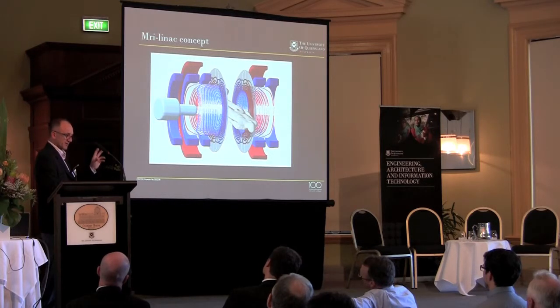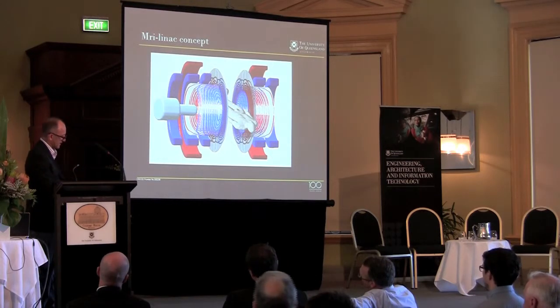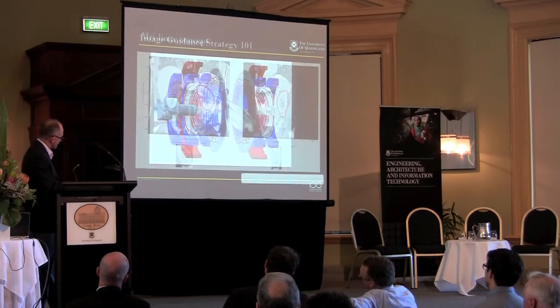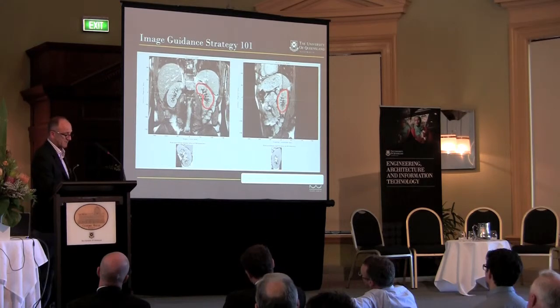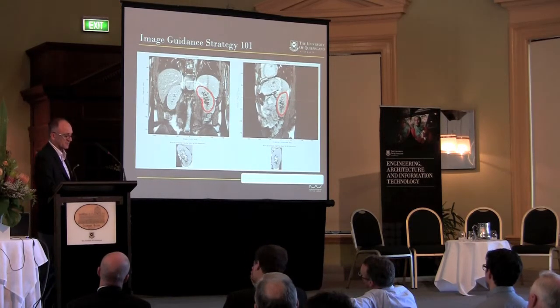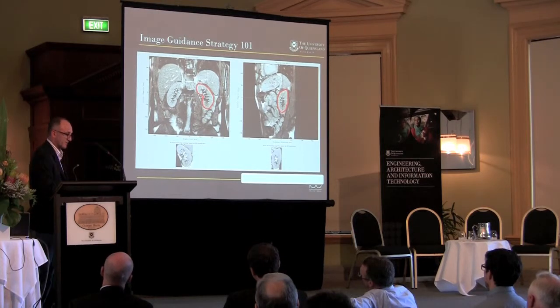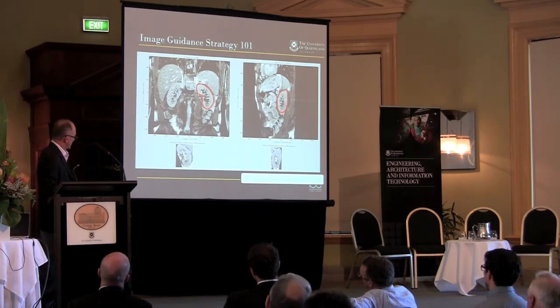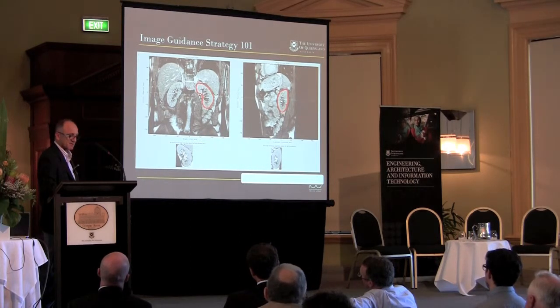If you let a spoon go near an MRI machine, it could kill someone. It accelerates so quickly into an MRI machine. The magnetic fields are so strong, so it's a major challenge to get those two things to work together. But we believe we know how to do it. One of the challenges is that we have to develop tracking software. You have to be able, in an MR image, to find something in that image and track it, and that has to be done in real time. We have to be able to do that several times during the breath cycle. We've developed prototypes of this so far, and this is motion tracking software picking up one of the kidneys, just as an example of how it is done.